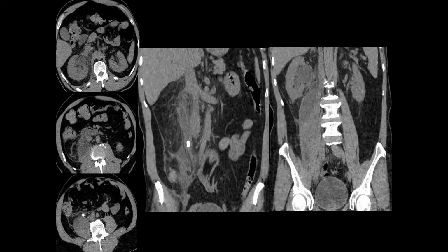So renal stones. Renal stones are a common request, and in our department we get patients with flank pain to rule out renal stones. The most sensitive modality, as you all know, to assess renal stones is CT scan. Sensitivity is more than 95% for renal stones. And it's much better than ultrasound, especially for stones less than 4 millimeters. It's much better than ultrasound for ureteric stones.